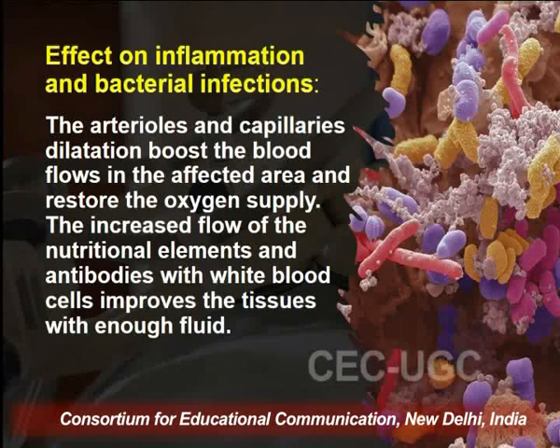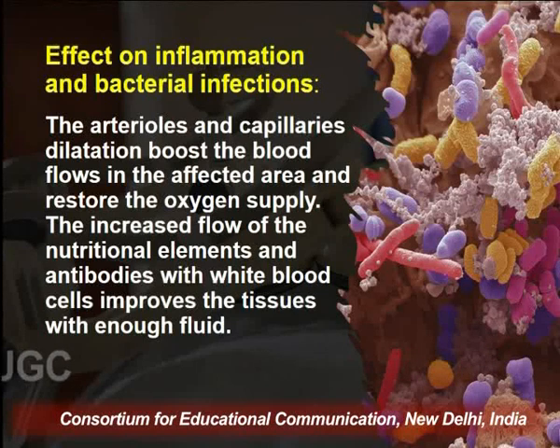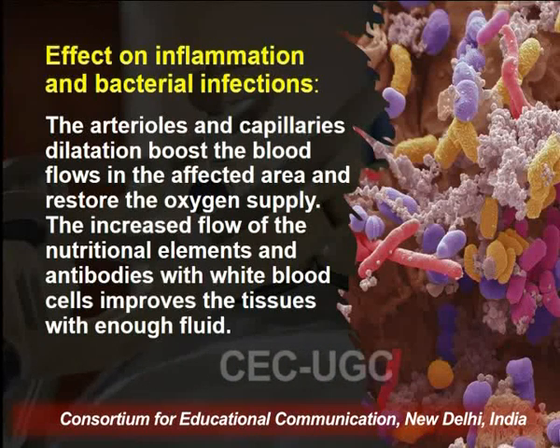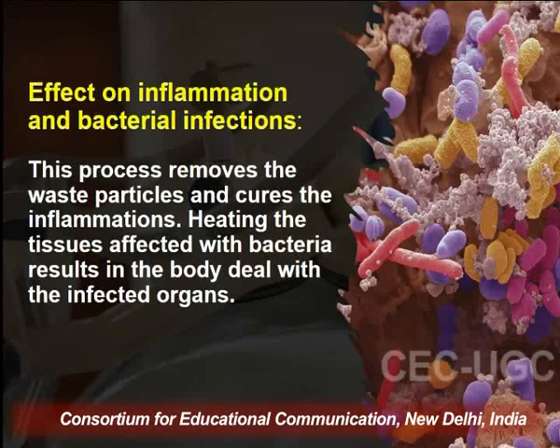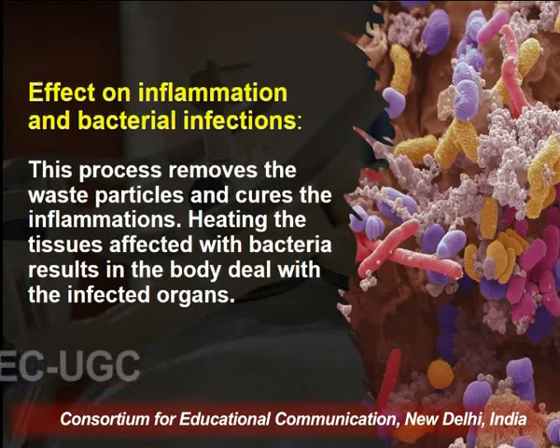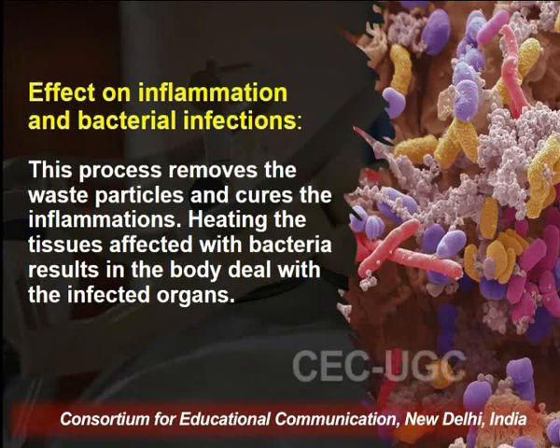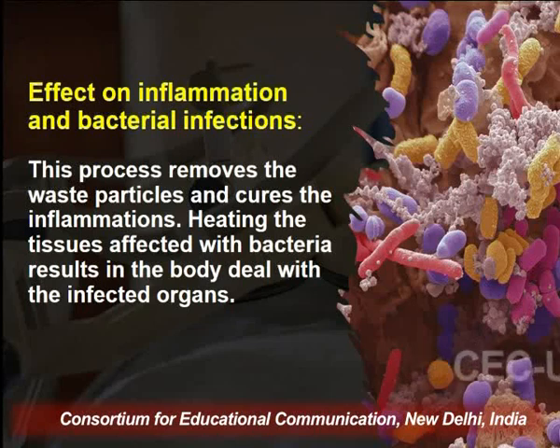The increased flow of the nutritional elements and antibodies with white blood cells improves the tissues with enough fluid. So, this process removes the waste particles and cures the inflammation. Heating the tissues affected with bacteria helps the body deal with the infected organs.